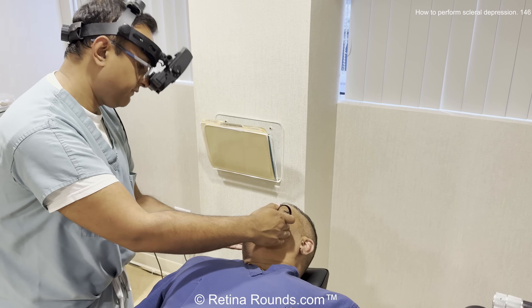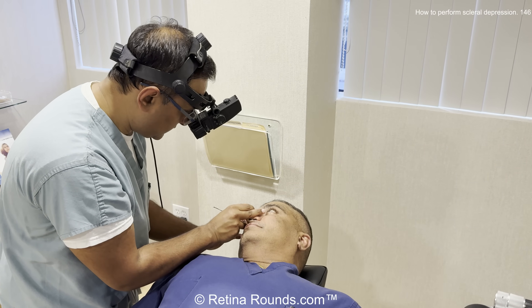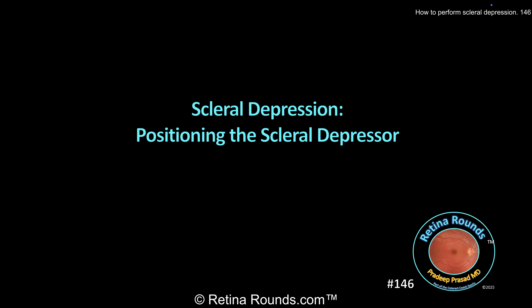Here we're taking a look at the 9 o'clock position — I'm depressing there at 9 o'clock, and then my eyes, the line between my two eyes, is also at the 9 o'clock position. Now I'm going to take a look at the supratemporal quadrant. I turn the patient's head over towards me. I have them looking up supratemporally. My depressor is supratemporal. And now you can see, if you look at the line between my two eyes, that's also pointed supratemporally.